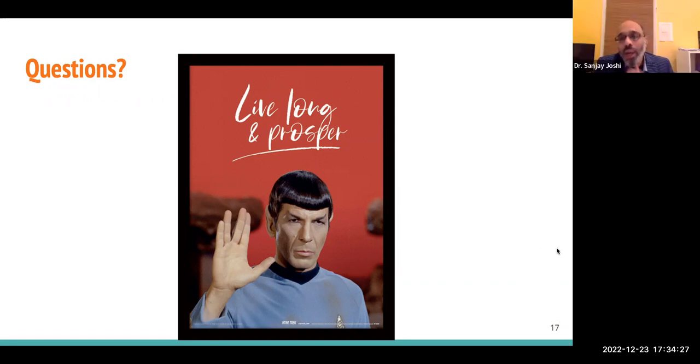Yeah. So in my talk, Dr. Chatterjee, I did not cover FMEA. I covered only the risk analysis part of it, because the standard usually talks about risk analysis. They don't talk about FMEA. Having said that, we almost do FMEA. And the way I look at FMEA is basically exactly the other direction of risk analysis.